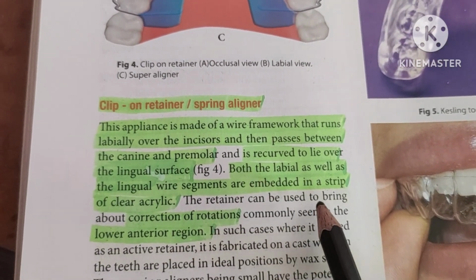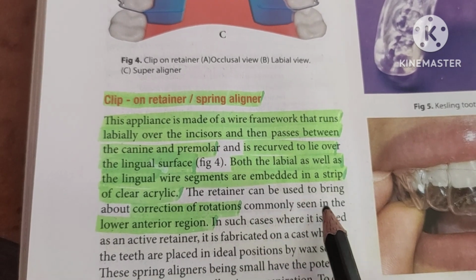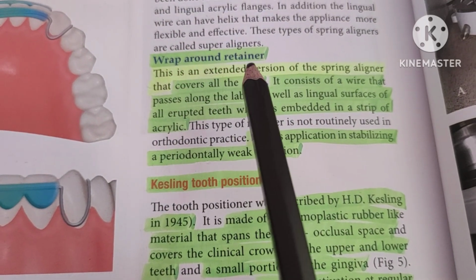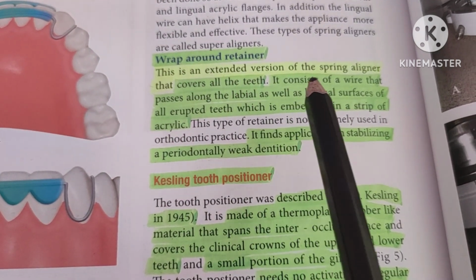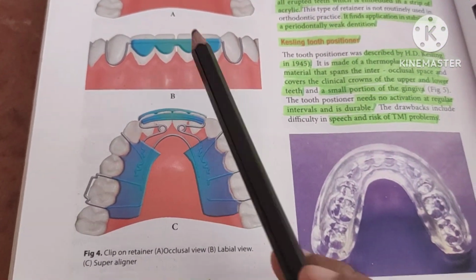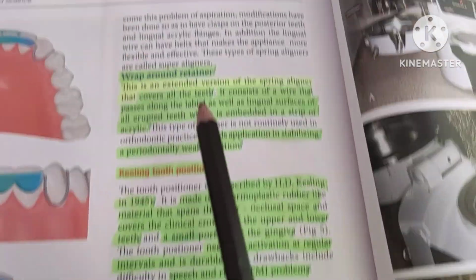This retainer can be used to bring about correction of the rotation commonly seen in the lower anterior region. Now the next is the wrap around retainer. This is an extended version of the spring aligner that covers all the teeth. As we know, the spring aligner covered only the anterior teeth. This covers all the teeth.